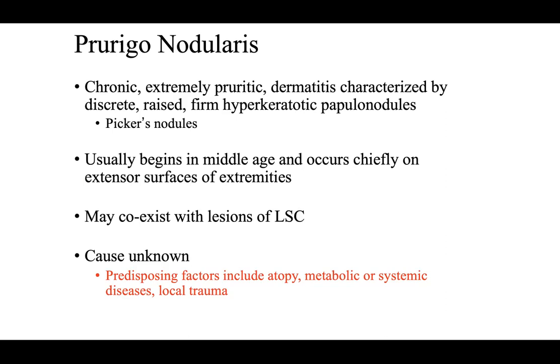But the important thing is to rule out pathology that is related to a malignancy or some other type of pathology. So most of the time we're trying to rule out prurigo nodularis versus SCC when it's a fully developed prurigo nodule. When it's a fresh papule, a pink papule, it's not fully excoriated, those are going to be more high yield because we'll be able to see, is there an underlying spongiotic dermatitis? Is there an underlying psoriasis? Is there an underlying interface or vacuolar or lichenoid interface change? So is there an underlying dermal pathology happening?